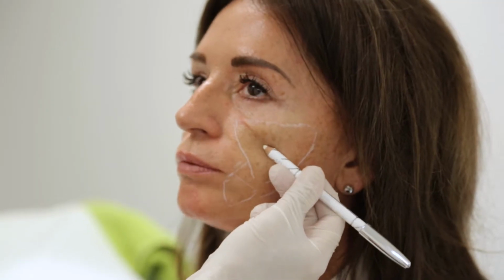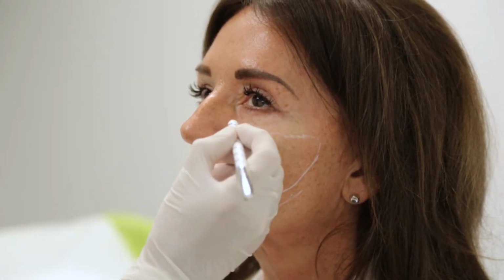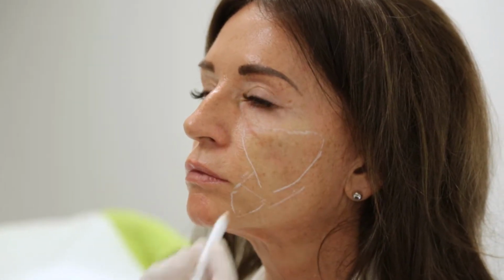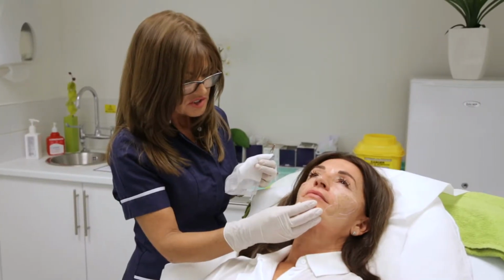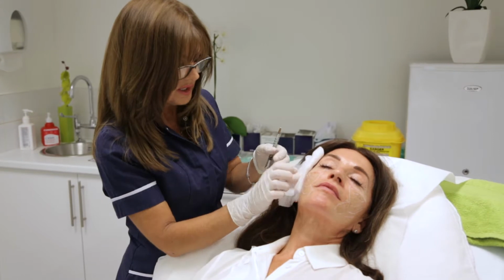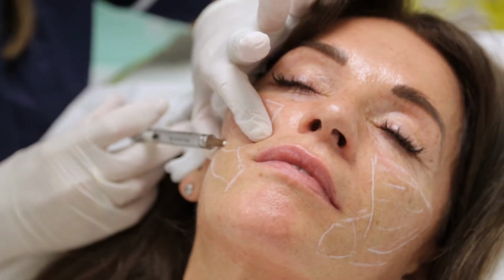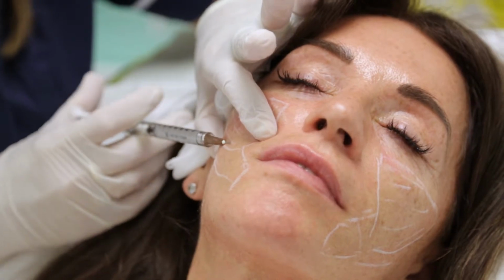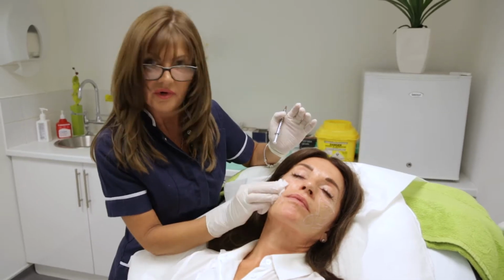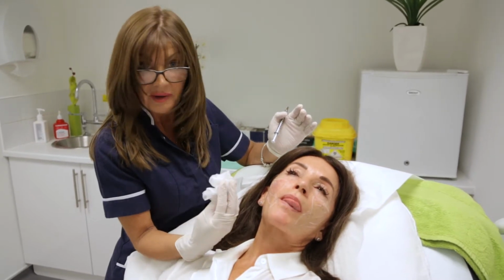This is the middle bit here where I want to concentrate, and what we have to be is very careful on the eye area because you've got a lot of nerves around here that we don't want to touch. What I want you to do is just turn your head that way, and if you can close your eyes for me, okay? And the first one you will feel, okay, and we'll let that settle in. So what will happen now, it'll feel more numb around this area because the product's actually mixed with the lignocaine. It'll be more comfortable for Babs to have.